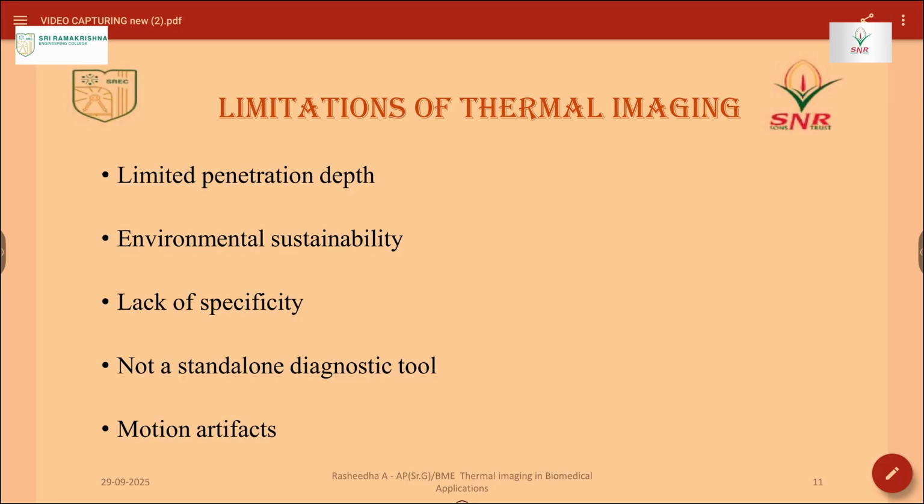And motion artifacts are also an important limitation of thermal imaging, and the technique often lacks specificity, as similar heat patterns may appear in different conditions such as infections, inflammations or injuries, making diagnosis less precise. Thermal imaging also provides limited anatomical detail compared to advanced imaging techniques like MRI and CT. We need to agree that interpretation requires trained professionals, and in most cases it cannot be a standalone diagnostic tool, but rather a supportive method. Yes, it can act only as a supportive method.